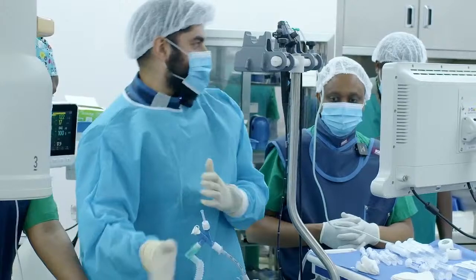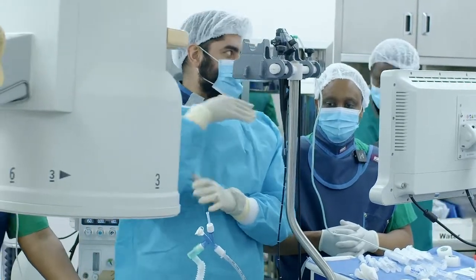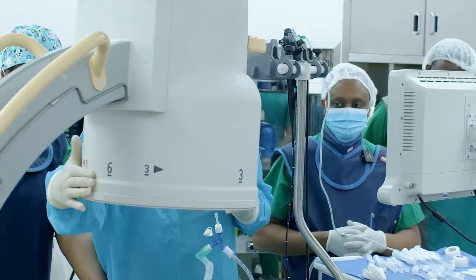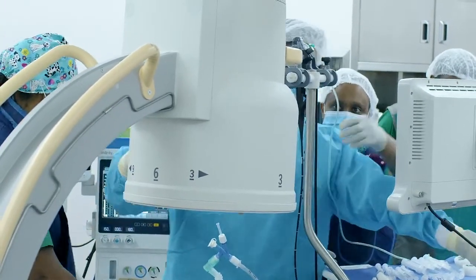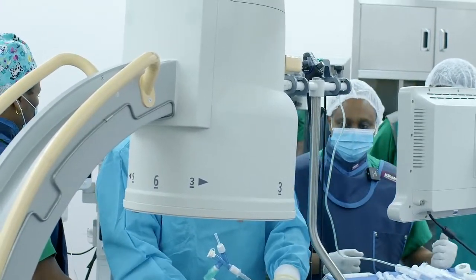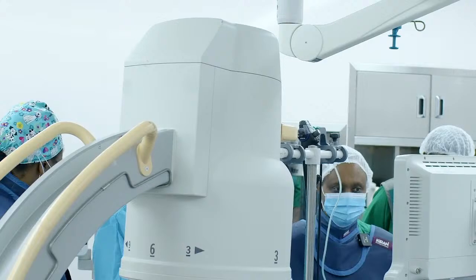Okay, so I like to get the cables out of the way because everything just looks funny on the fluoro. Yeah, it starts to look off. So you just use something to sort of direct. There's a big cable, yeah.